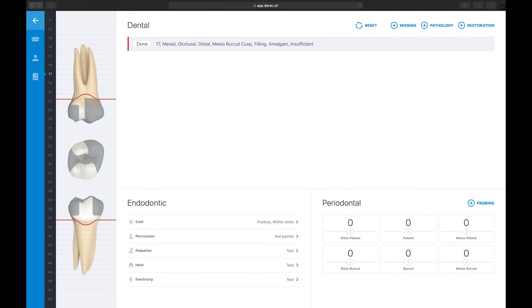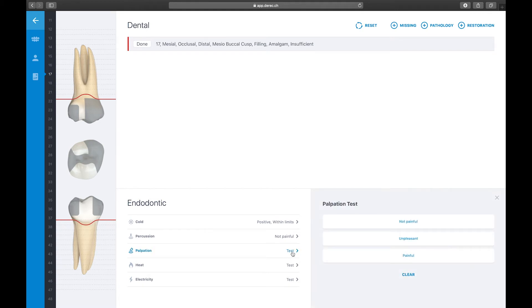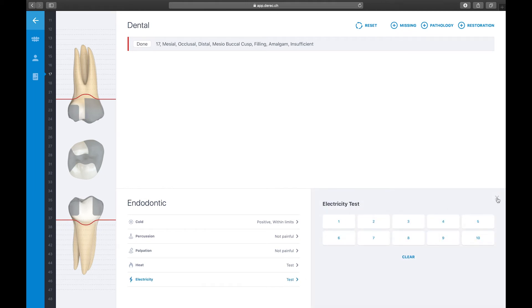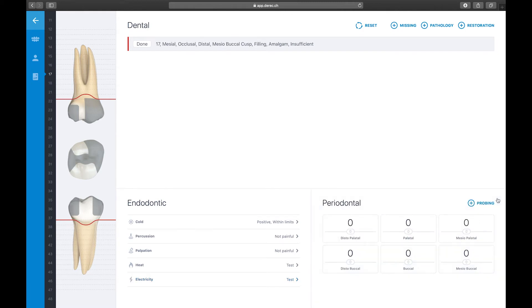Let's dig into entering endodontic test results to the tooth. In the endodontic section, you have several endodontic tests to choose from. Note that the cold test and the percussion test are already filled out since we entered these findings through the Quick Select function. Let's add the palpation test to record if the bone is tender to palpation in the region of tooth 17. Select Palpation, then choose the patient's reaction — in our case, not painful. The heat and electricity tests are used when you need to test the pulp with heat or perform an electronic pulp test, for example in trauma cases.